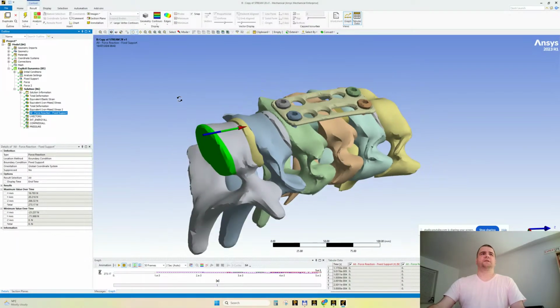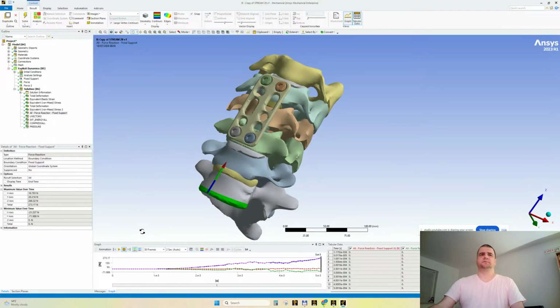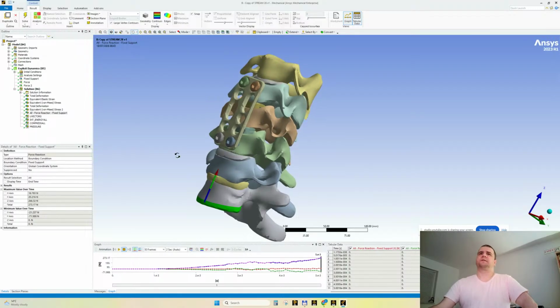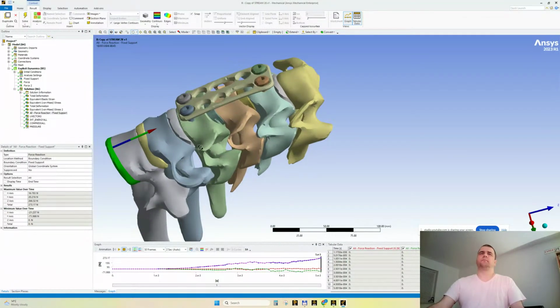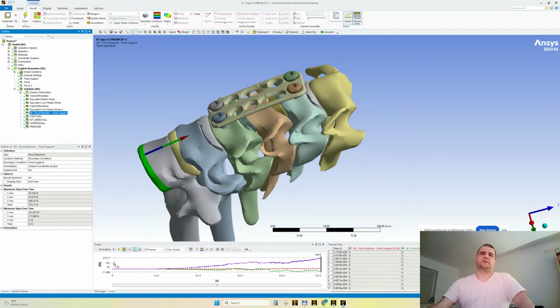Yeah, it's so nice. Force reaction. We have a decent value. Not this one. This is not so decent. Because you applied 70 plus 40, 100, almost 110 or something, 115, and this is not so cute. We do have a shock. When you apply this load, instead of real time, this load should have been applied in maybe 1 second or more. When you have such a shock, such a force reaction is expected, due to high acceleration. It's like an impact simulation, like a shock simulation.